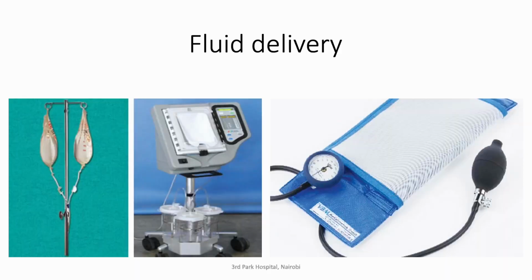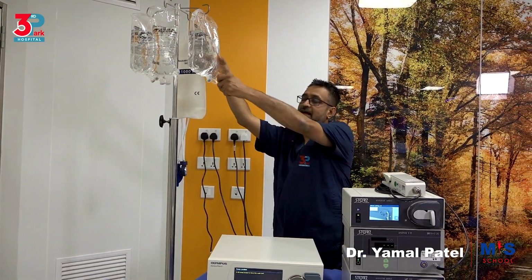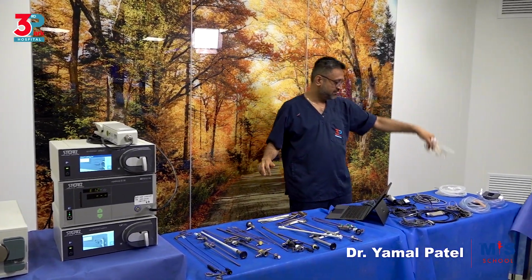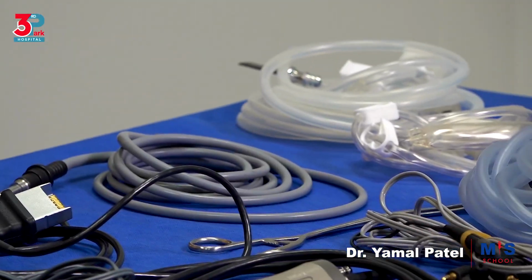We next move to fluid delivery. So we need fluid, and we need a fluid delivery system. The fluid delivery systems are of three types in hysteroscopy. We have gravity, where you connect it to this fluid, and you have the tubing. We can have the regular twin tubing. These are all tubings for hysteroscopy. And then you can have the tubings that connect to these machines.